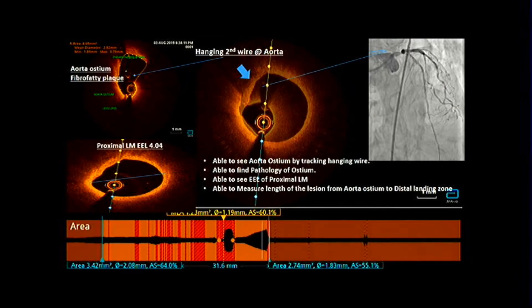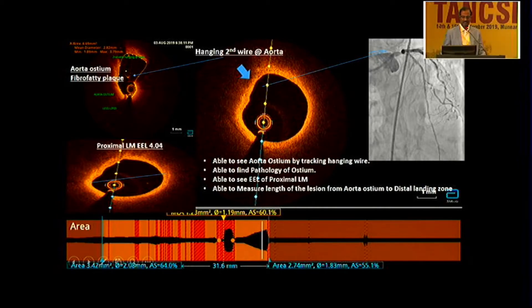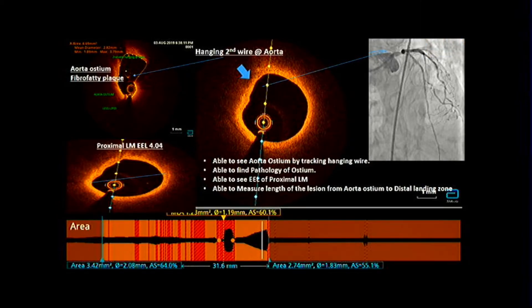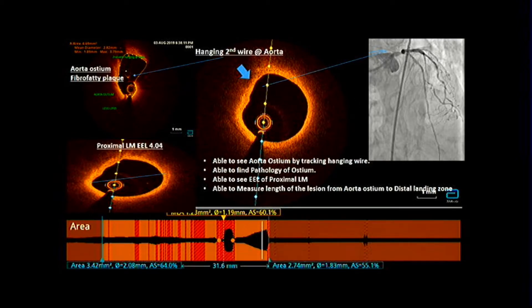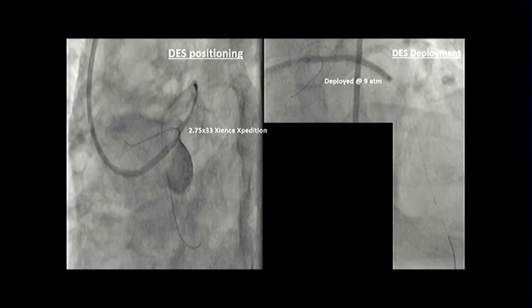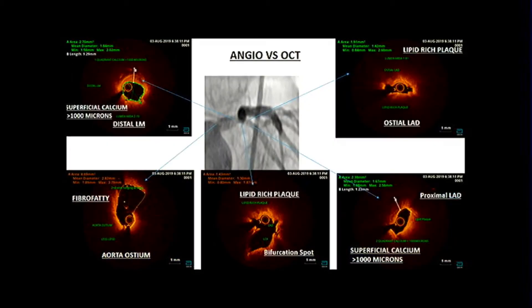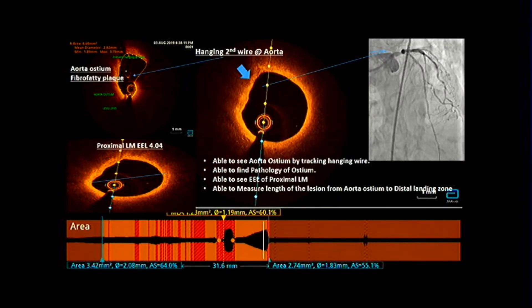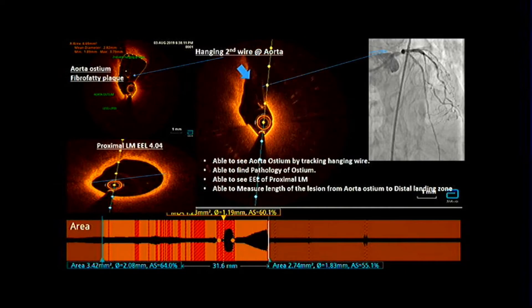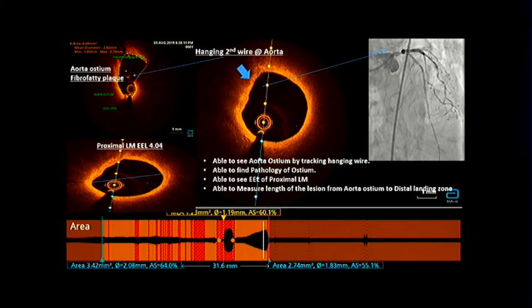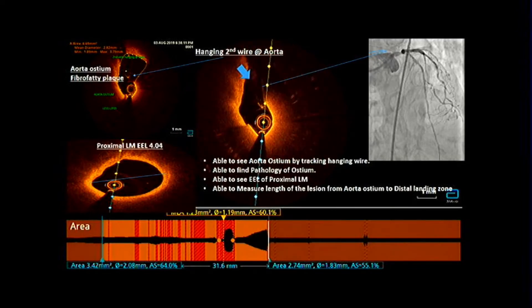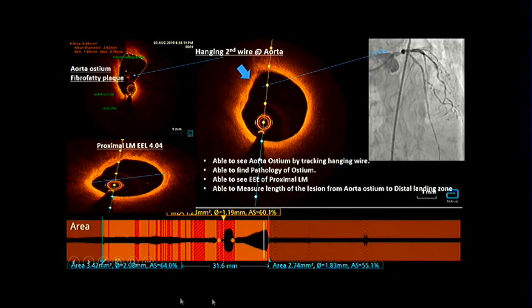A hanging wire technique was used so that the guide could not impact the deployed stent. With that hanging wire, I was able to trace the ostial left main — which is not usually possible with OCT. So what is seen inside is the hanging wire, and with that I could see the ostial left main and measure the length as 31.6 mm.